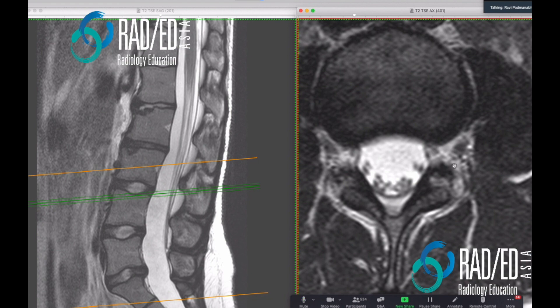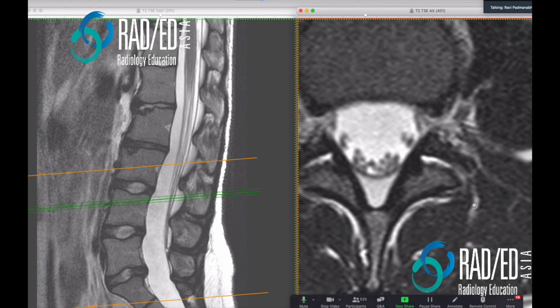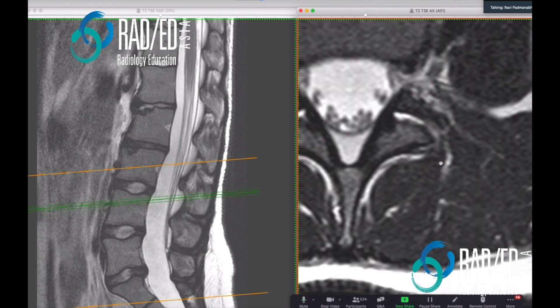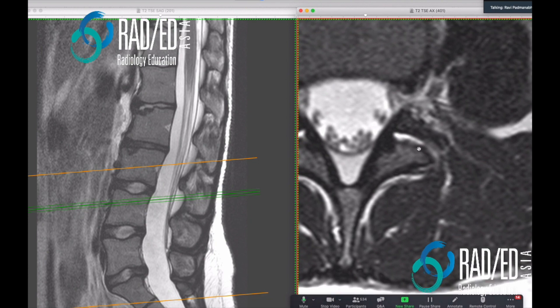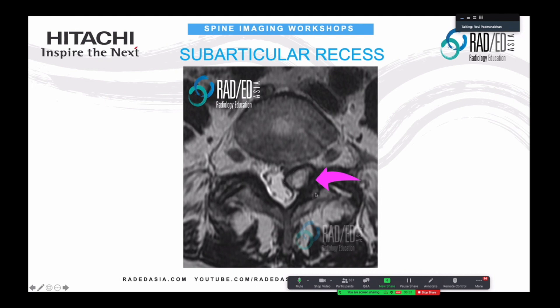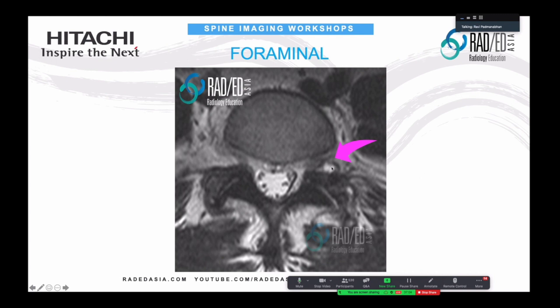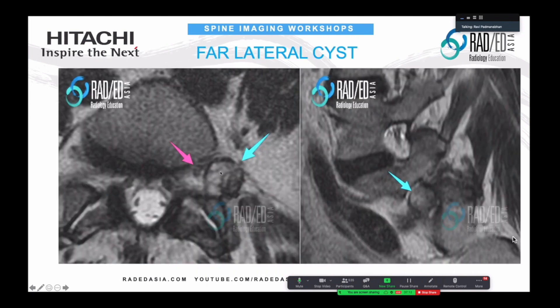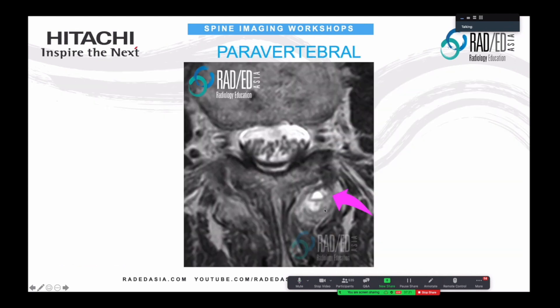We can look for cysts within the foramen, and we can look for cysts outside the foramen in the lateral region. Another area that is commonly missed is posterior paravertebral cysts, which come out of the posterior margin of the facet joint. The more clinically important ones are anteriorly located because those are the ones that can compress nerve roots. Cysts within the subarticular or lateral recess affect the traversing nerve roots, cysts within the foramen affect the exiting nerve roots, and lateral cysts also involve the exiting nerve root.